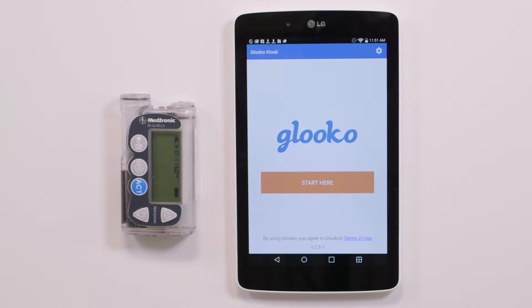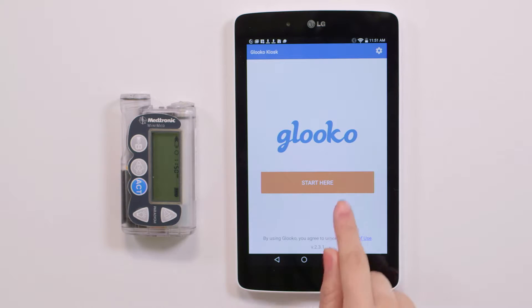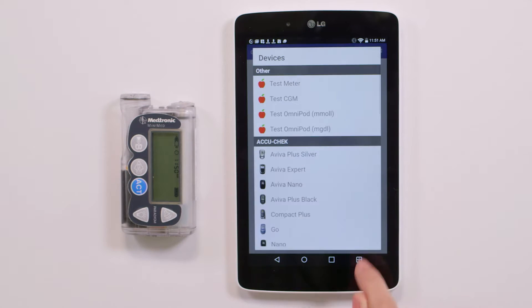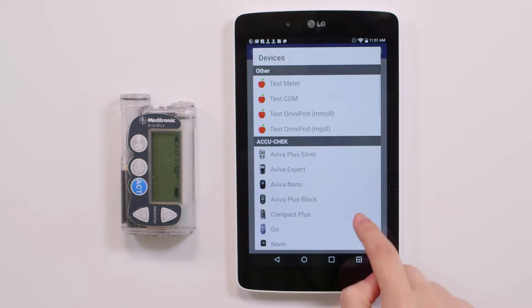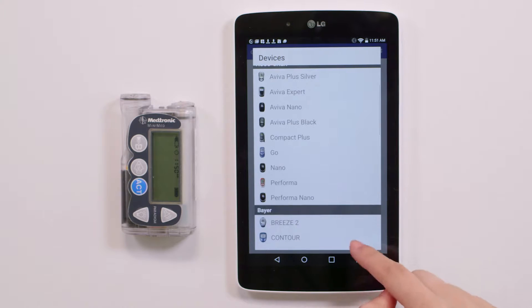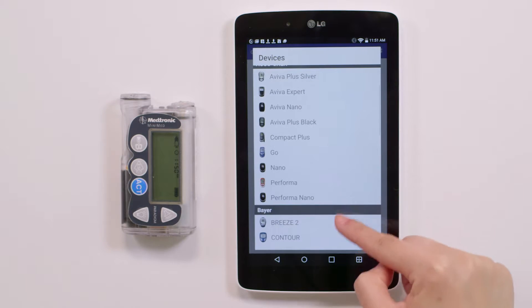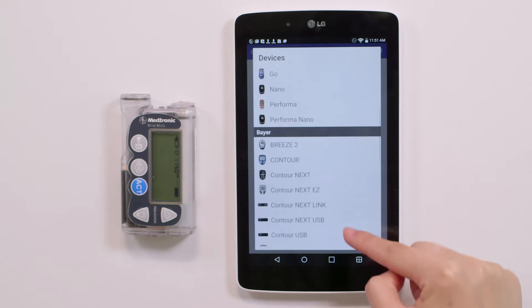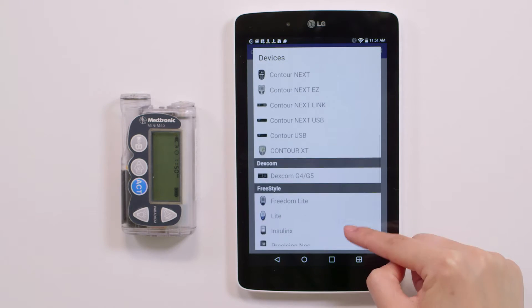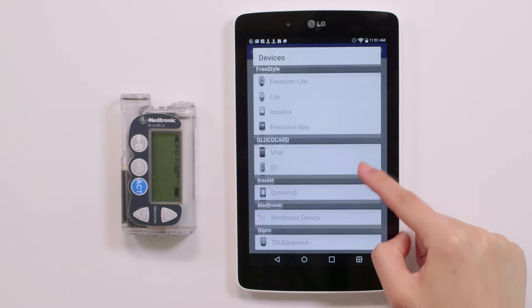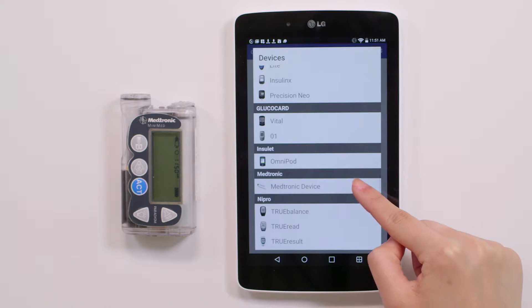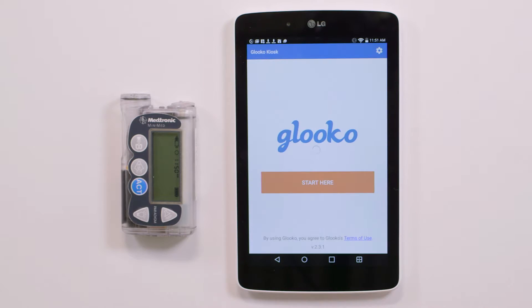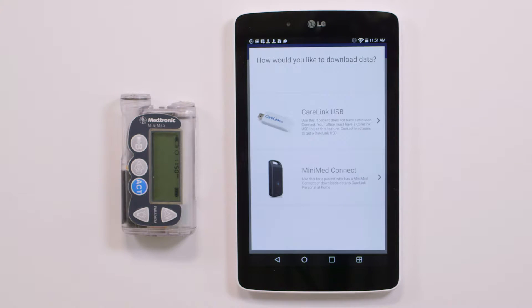From the kiosk home screen, tap Start Here. You'll find our list of supported diabetes devices. Scroll until you see Medtronic. Tap Medtronic to open the Download New Data screen. Tap MiniMed Connect.